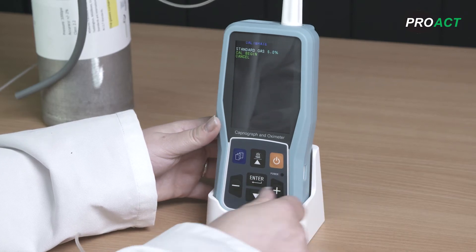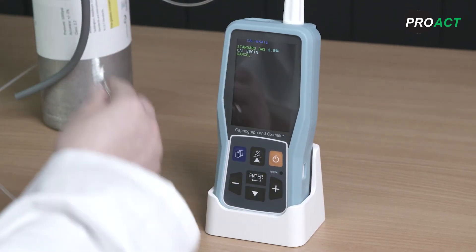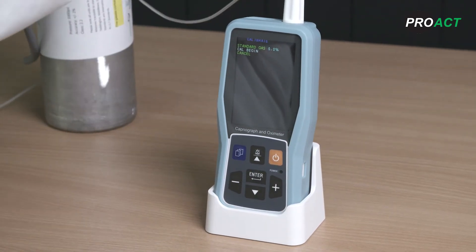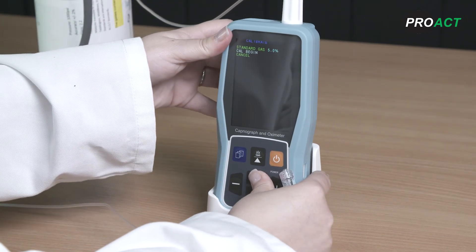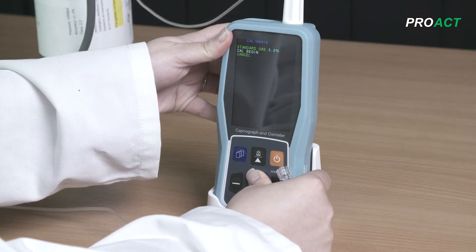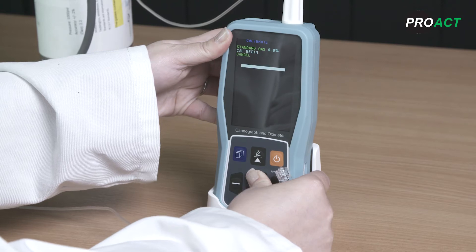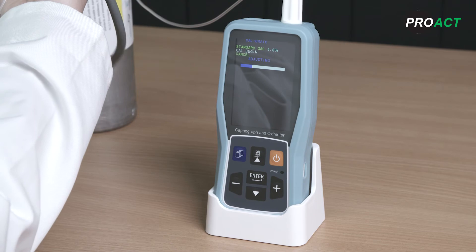Check that the device shows your gas is 5% and scroll down to cal begin. Hold down the enter button until a white bar appears across the screen.